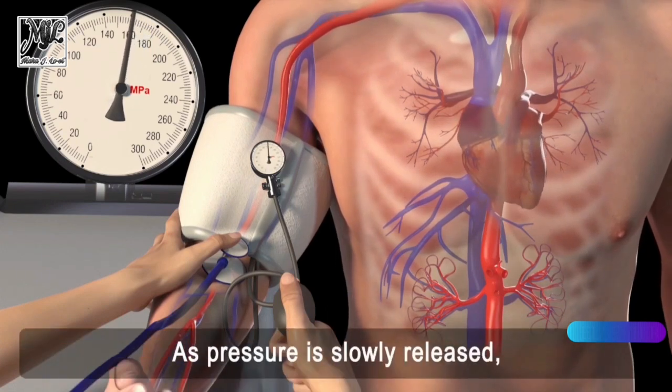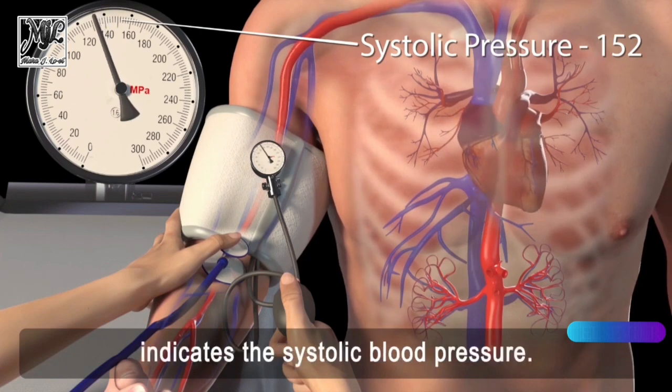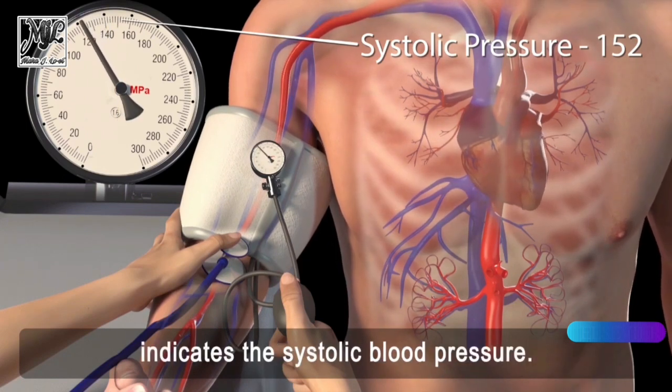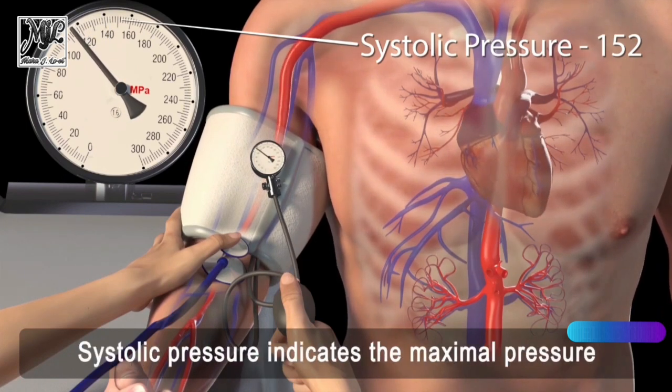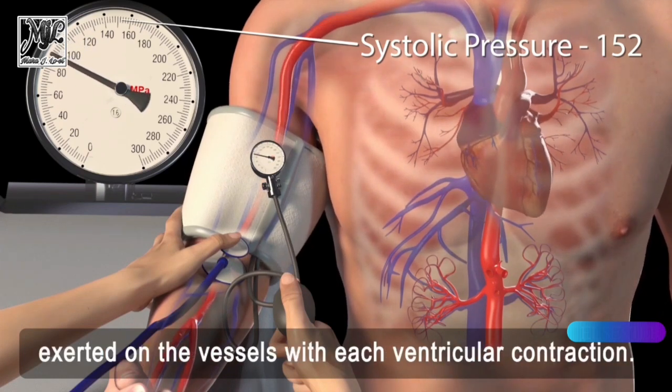As pressure is slowly released, the first clear tapping sound heard, or Korotkoff sound, indicates the systolic blood pressure. Systolic pressure indicates the maximal pressure exerted on the vessels with each ventricular contraction.